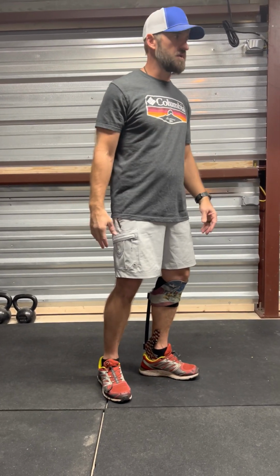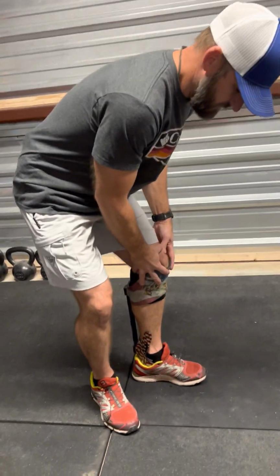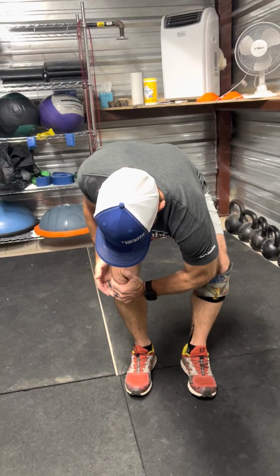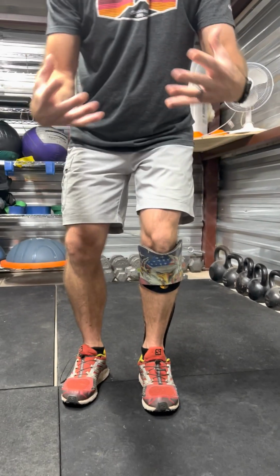He sees you, just like I said, they see this, it's not cut and dry, it's really gray. So he sees what you have, and he knows all that. He knows how to unload you. So the unloading comes from the cuff holding me up right in this area here. So it's right there. It's pushing on my patellar tendon. It's underneath my knee. It has a good grip on me.